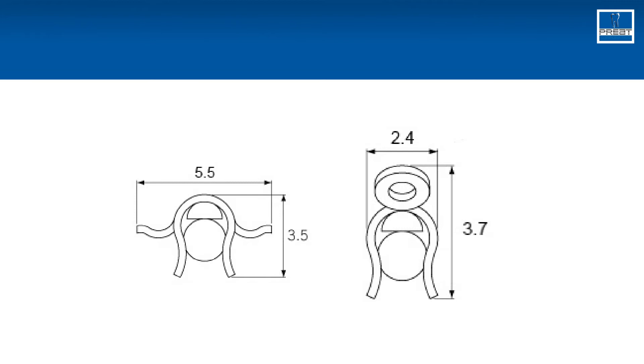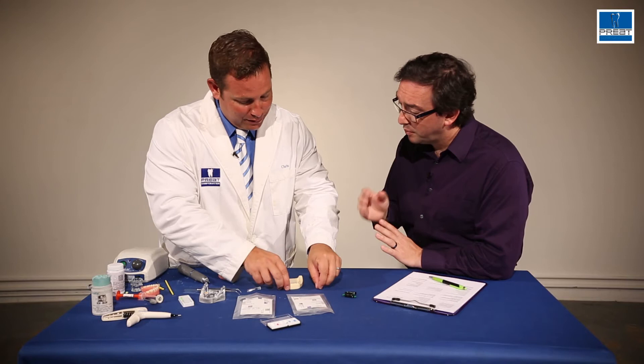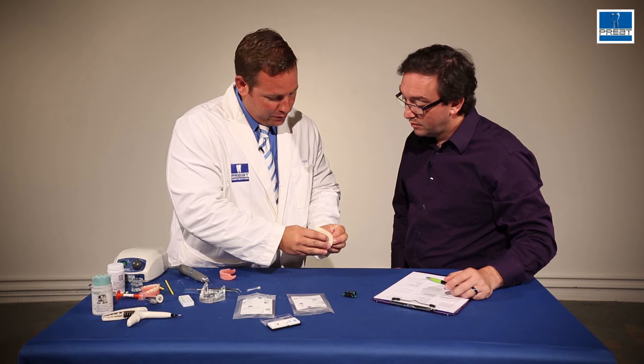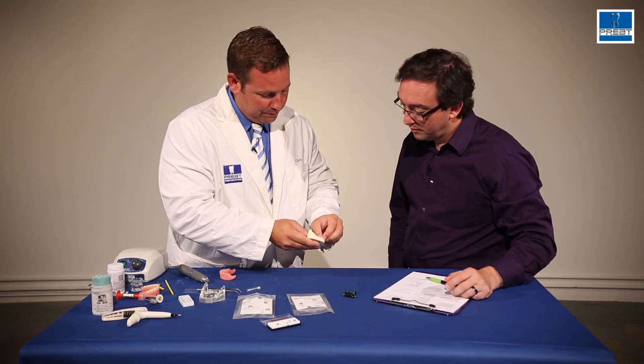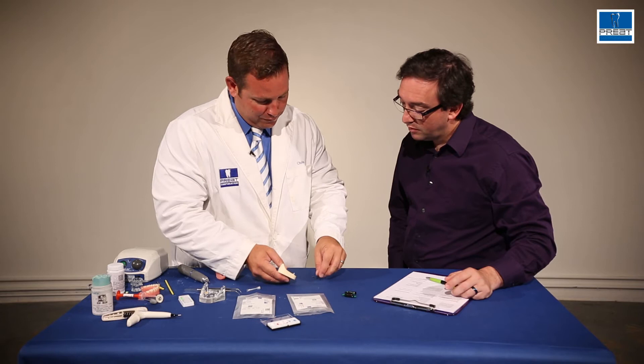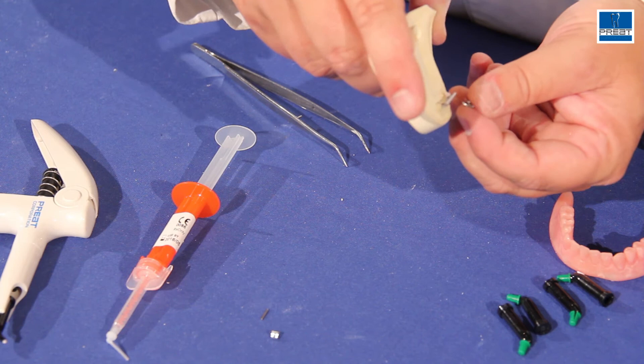So here's the procedure for picking up the Ackermann clips. The Ackermann clips are an all-metal clip. One of the things you'll notice about the Ackermann clip is it comes with a little half-round spacer, which is the most important part of the system. And this is part of the vertical space that we're interested in? Absolutely. If you put the Ackermann clip directly onto the hater bar, you'll find that it's very loose and does not provide very much retention at all. However, if you take the same clip but seat it on the bar using the half-round space maintainer, what you're doing is elevating the position of the clip so that the narrow part of the clip is in contact with the bar.